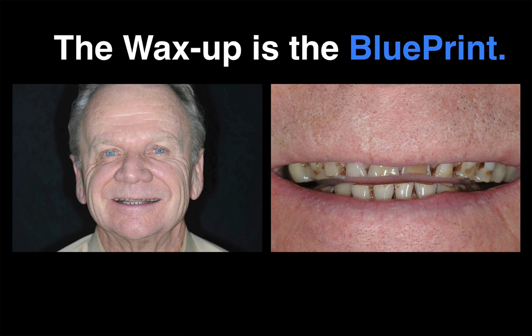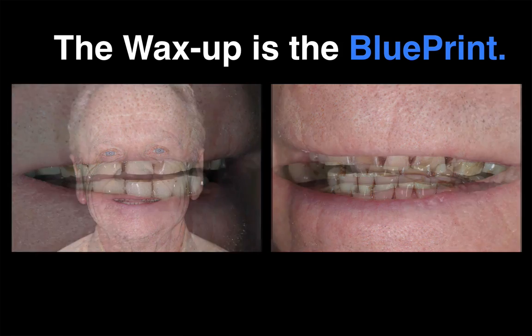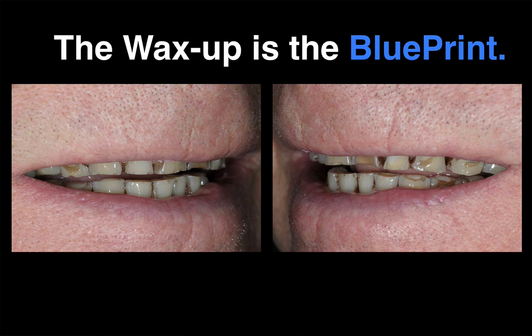Here's this particular patient. If you look at his before pictures, we didn't have to prepare the teeth a lot. The erosion and the attrition have prepared the teeth a lot. I had to prepare the teeth interproximally so that the jacket crowns would go over the teeth, because I felt there was too much facial erosion to really promote porcelain veneers. But jacket crowns, conservatively prepared, are a good option for a patient like this with this much facial and incisal erosion.